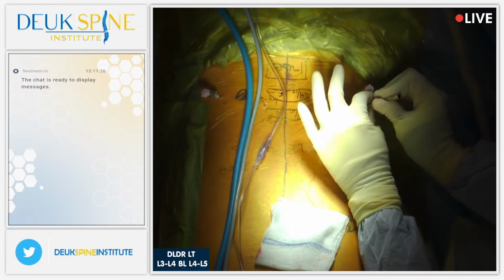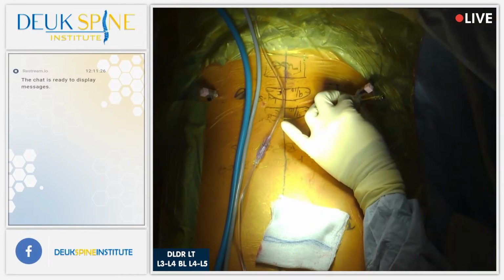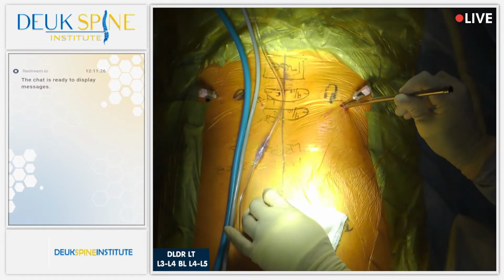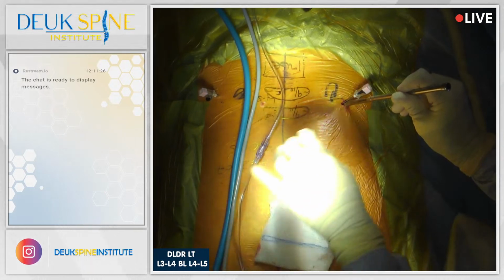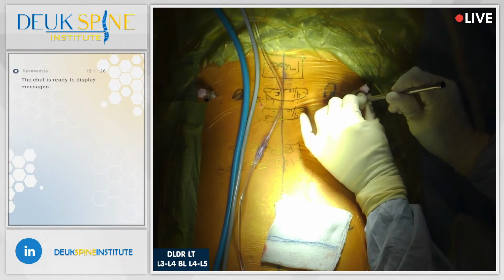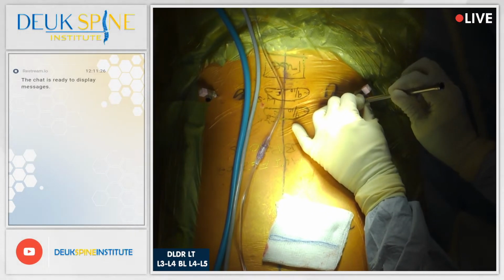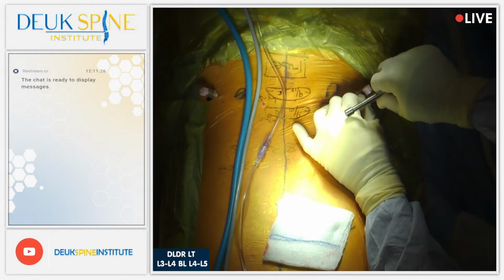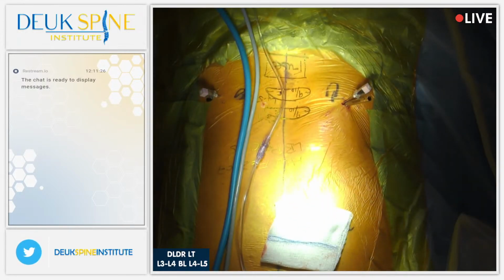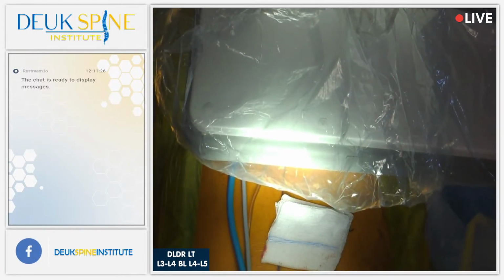Okay, next we're going to be putting in our tube that we're doing the surgery with. And of course we're using our x-ray machine to guide. Okay? So the x-ray machine is used for two things. It's very important to remember. Number one, localization. What does that mean? It means knowing which disc you're dealing with. And number two is navigation, localization and navigation. Arius, do you mind writing those two words down in the dialog box? X-ray is used for localization and navigation.